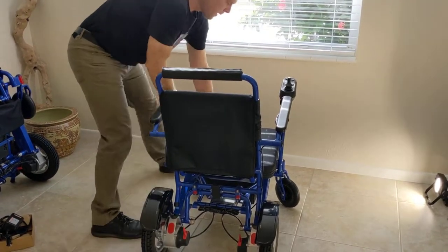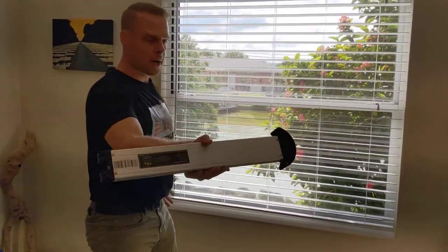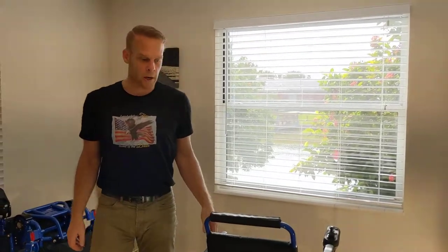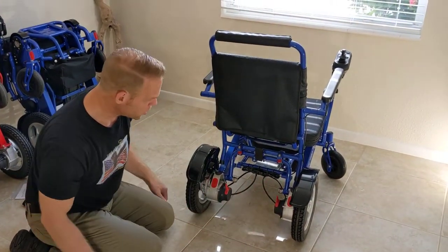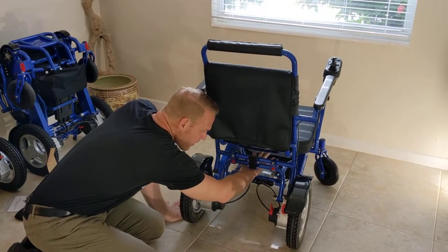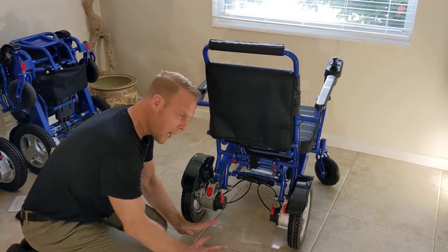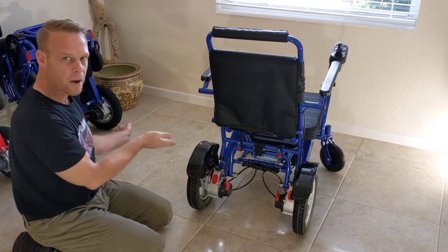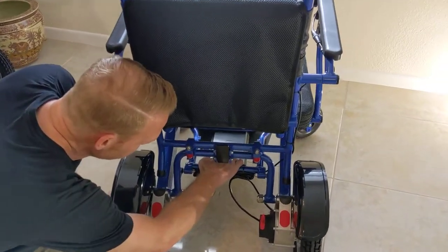With very little range of movement, I can take a battery out of the chair and then let gravity itself slide the battery back in. Compare this to other lightweight chairs where batteries are underneath the vehicle — you'd have to be on your hands and knees to deal with those batteries and then figure out how to get back up.